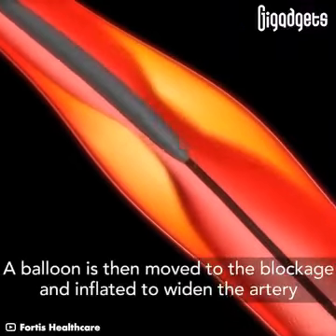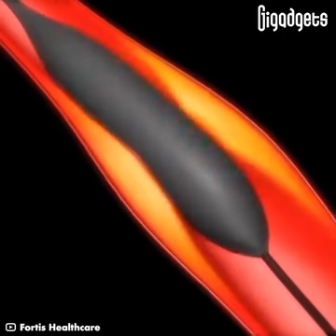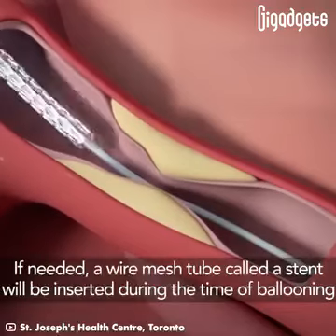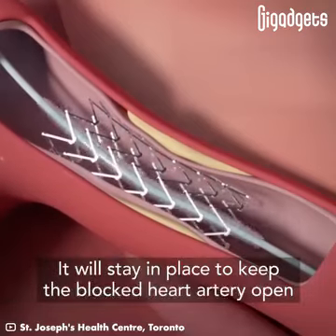A balloon is then moved to the blockage and inflated to widen the artery. If needed, a wire mesh tube called a stent will be inserted during the time of ballooning. It will stay in place to keep the blocked heart artery open.